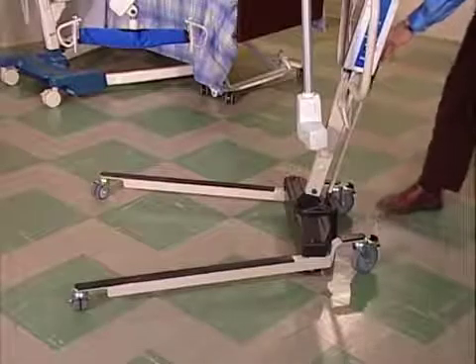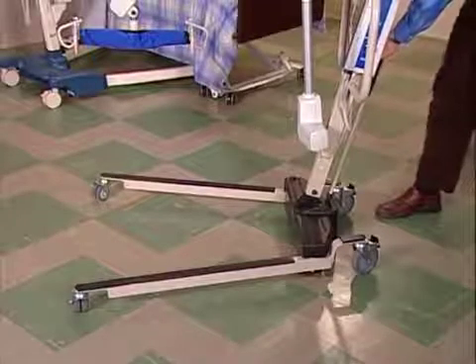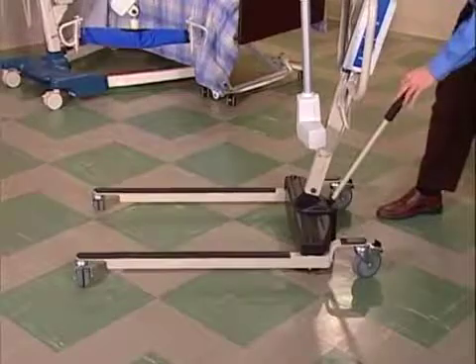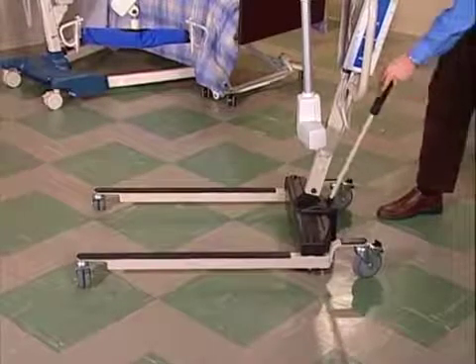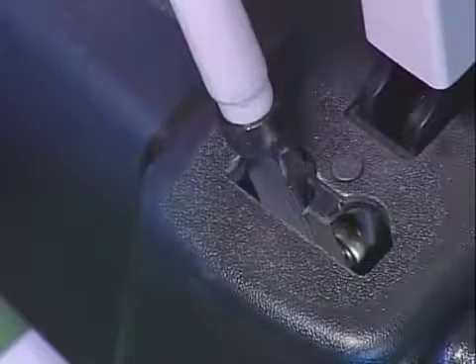To close the legs, just reverse the process. Grab the shifter handle with one hand and the steering handle with the other. Pull back and move the shifter handle to the left and the legs will close. Again, make sure that the handle drops into this slot to lock the legs into place.